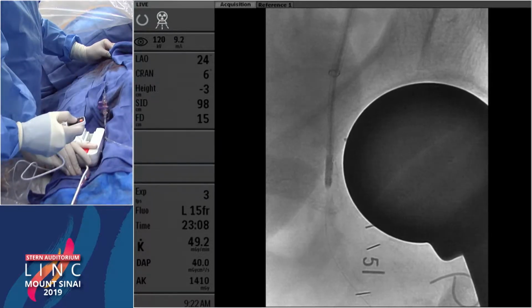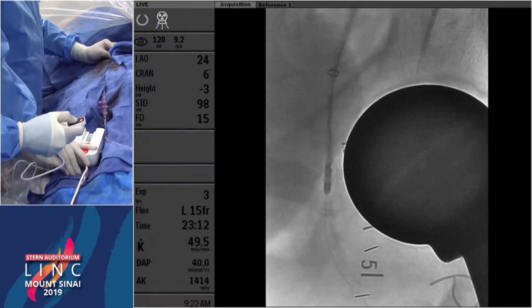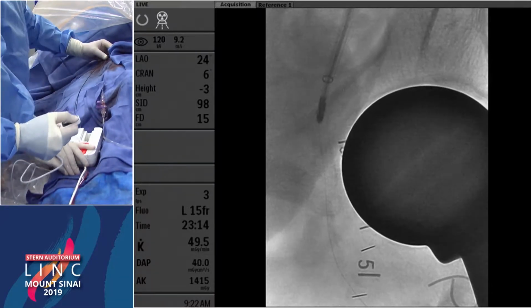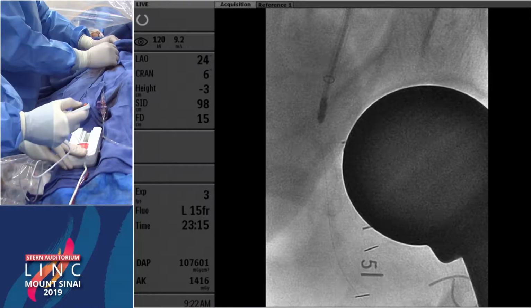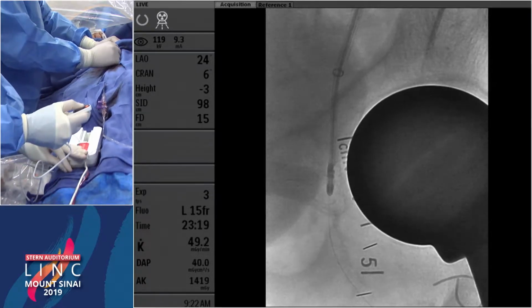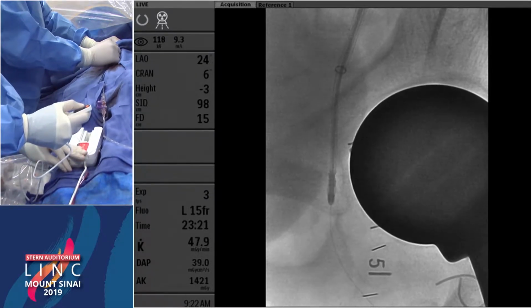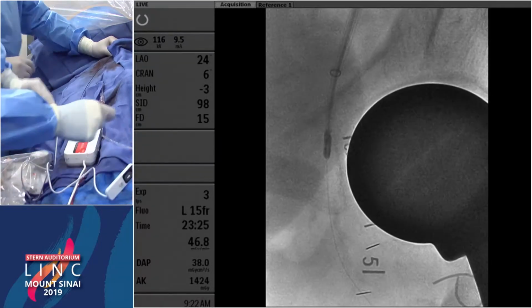So I would comment here, based on what Dr. Kump said, why would you not just stent it? Why not just primarily stent this lesion? You're above the profunda. You're not going to jail the profunda off. And based on that, why go through the expense and potential risk of embolization when you could just do a primary stent, take care of the lesion, and then go back and do something with the SFA?